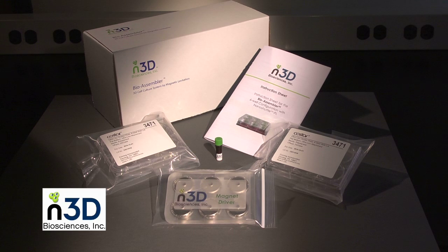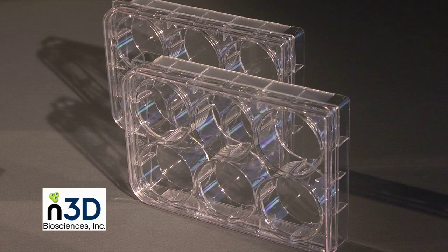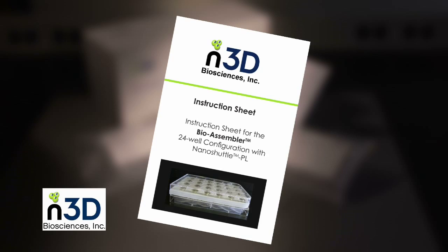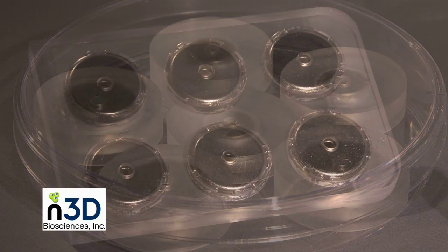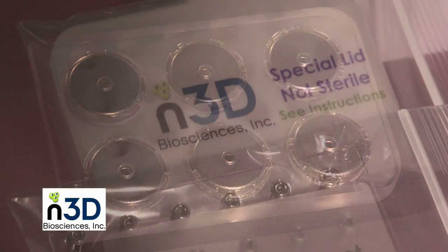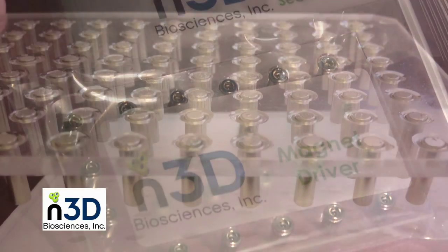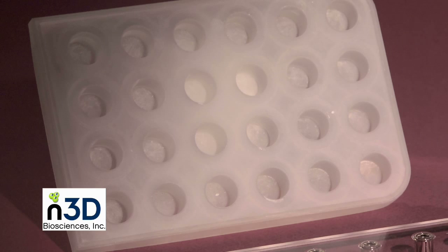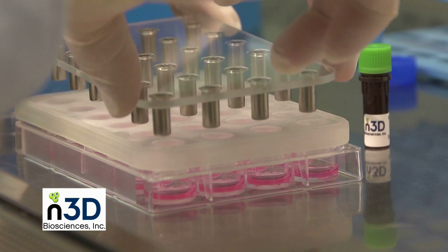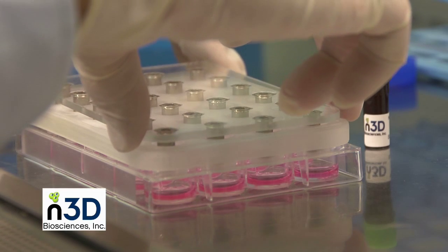Our kits contain a small number of plastic culture plates, instruction manuals, NanoShuttle PL reagent, and reusable magnetic drives that will be placed above the plastic culture plates to levitate the cells to form 3D structures. 24-well and 96-well kits come with a reusable culture isolation lid that allows the magnets to get closer to the cells.